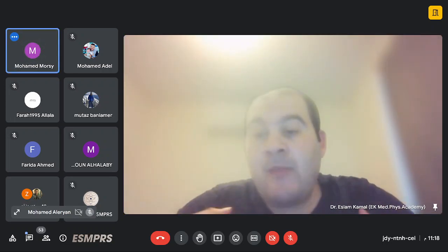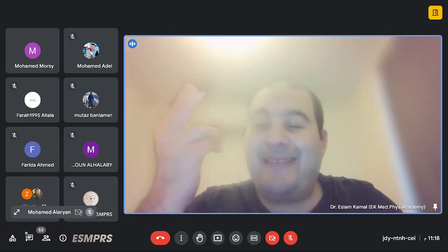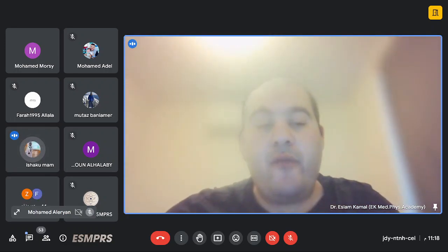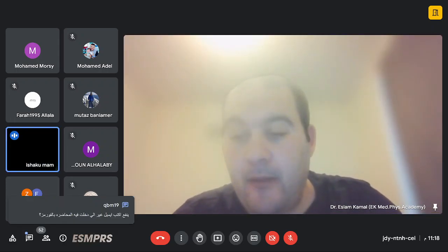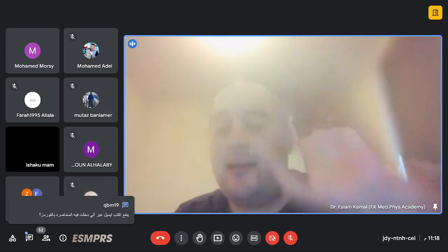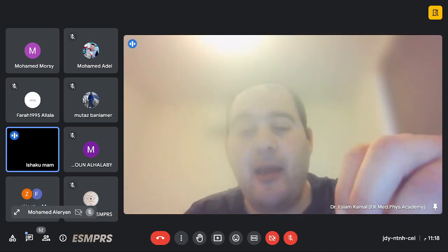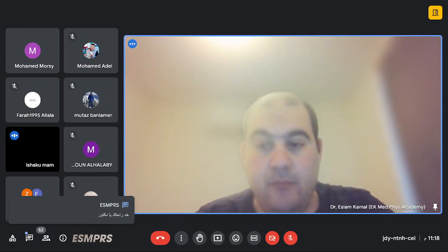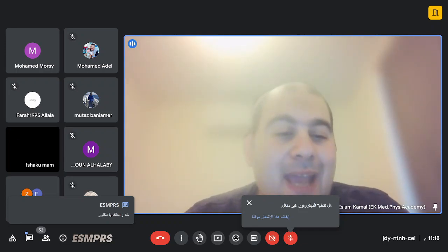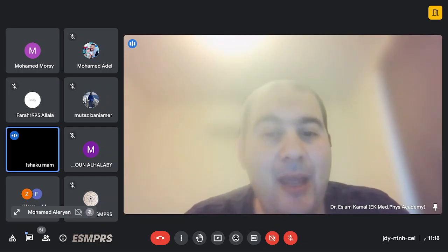انا دلوقتي لو خليت السيكونس بتاعي سبين ايكو بس، فانا عندي حاجتين، ام اكس واي وام زد. طيب انا لما اجي افكر واروح في الانفيرجن ريكفري، انا عايز افكر ليه؟ عايز اعمل كونتراست جديد يعتمد على خاصيه جديده، اللي هي انك مثلا عندك باثولوجي معين، هذا الباثولوجي فيه فات ووتر كونتنت. انت دلوقتي بتقول ايه؟ انا والله يا جماعه عايز اعرف هل الباثولوجي ده فيه فات ولا فيه ووتر، تمام كده؟ طيب تمام يا دكتور.